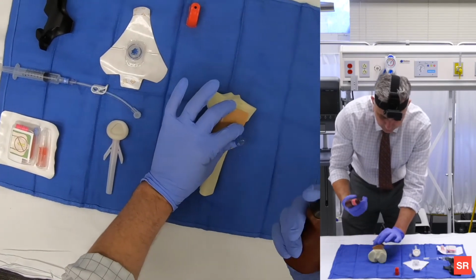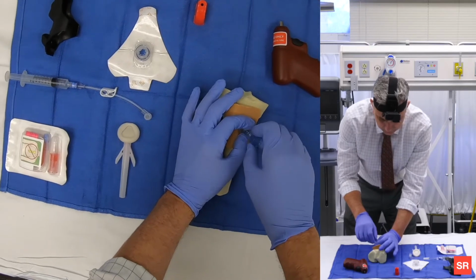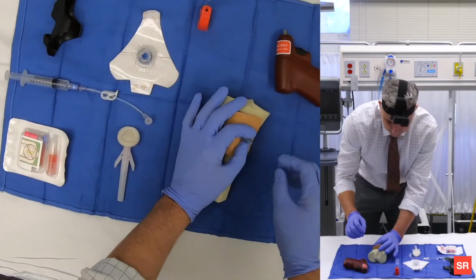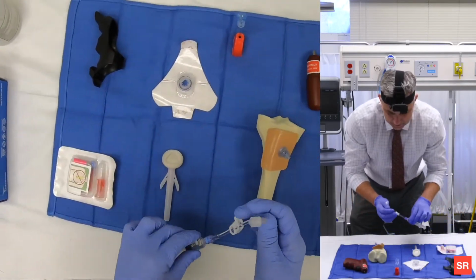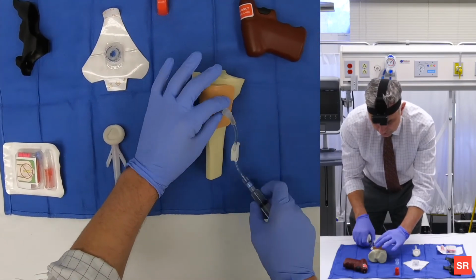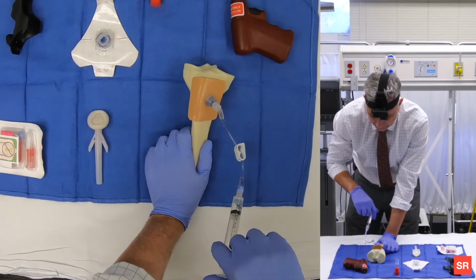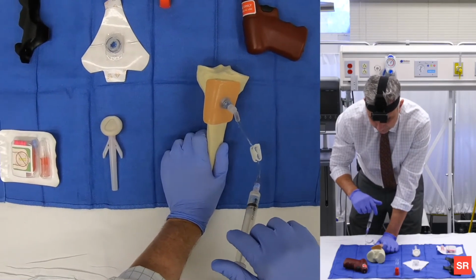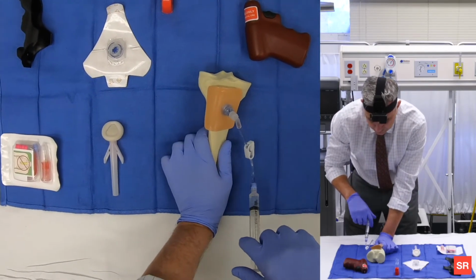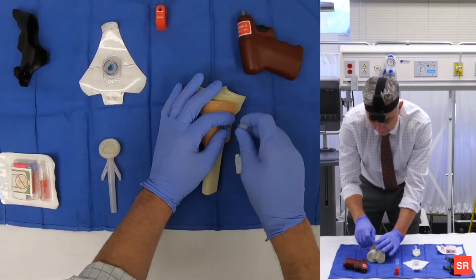I'm going to remove my drill, and remove the introducer needle. That's going to go into the sharps. Okay. At this point, I'm going to attach my IV, which is flushed already. With a pediatric patient, I'm only going to do 2 to 5 milliliters of fluid, a rapid flush, to make sure it's patent and that there's no swelling or infiltration around that site, which I don't see. So now I've successfully placed this intraosseous needle.